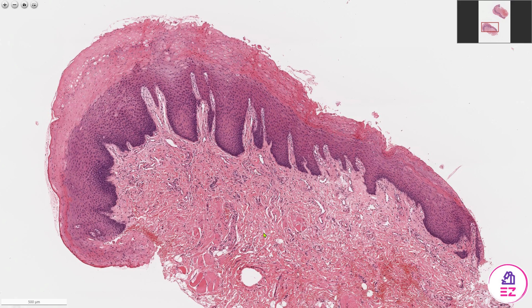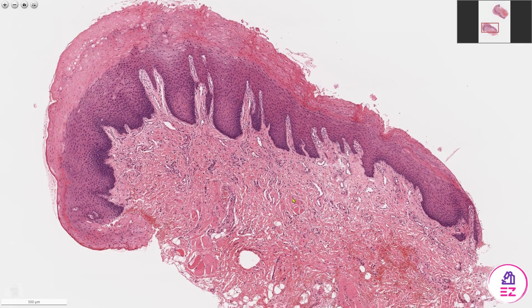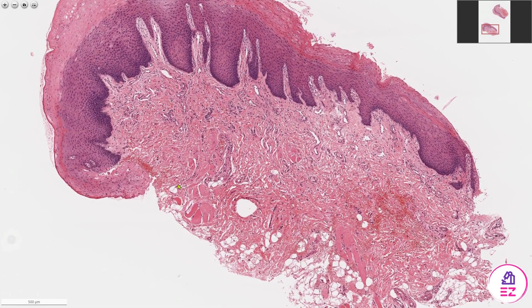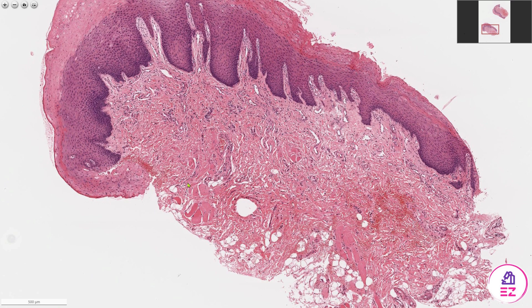This biopsy, like many of our biopsies, has been stained with haematoxylin and eosin. You can see the epithelium over the surface. Beneath that is the lamina propria. And finally, at the deep aspect of the biopsy, we have a submucosa.